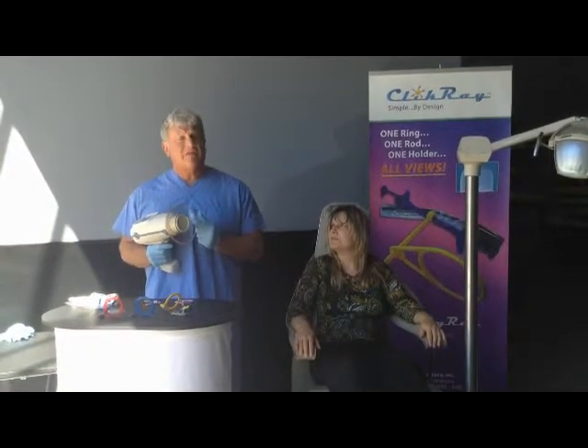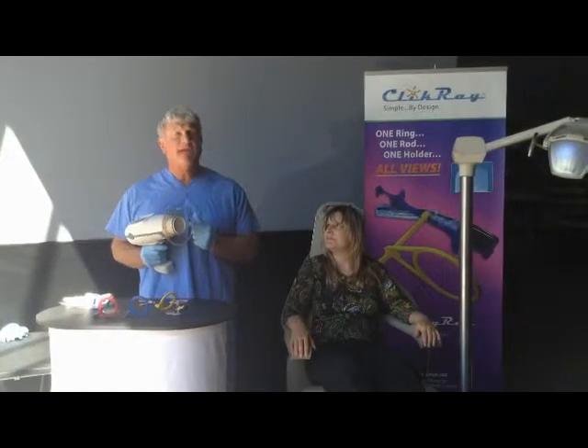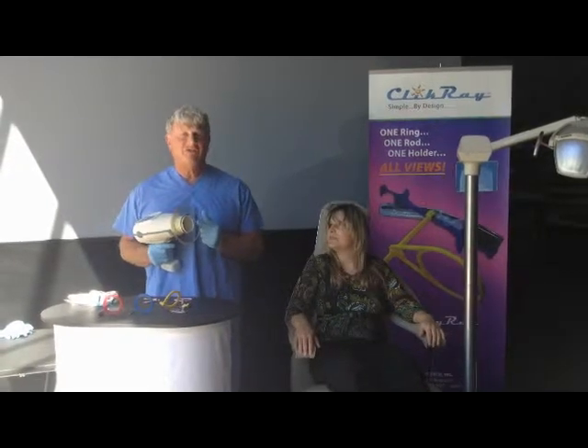In our system, that rod is infinitely variable, it's extra oral, it's not in the mouth, and we're able to get as close to the cheek as possible for a very high definition radiograph.